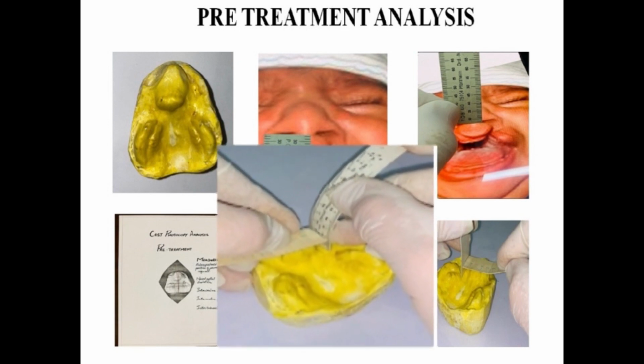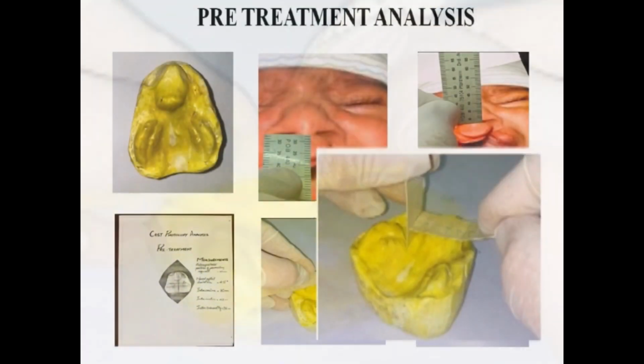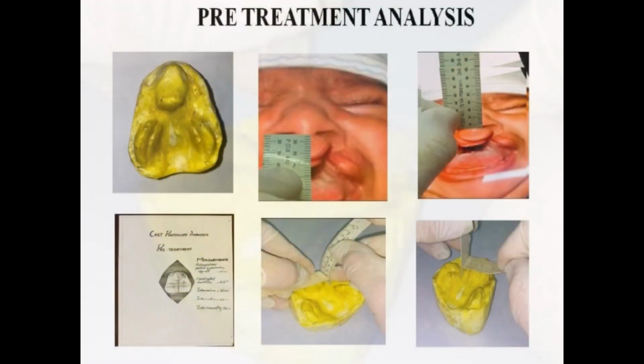The downward movement of the premaxilla is recorded directly on the cast with a soft vinyl scale, on both pre and post treatment casts. The scale is placed vertically in the deepest base adjacent to the premaxillary segment, and measurement is recorded at the level of the median landmark on the alveolar ridge of the premaxillary segment.